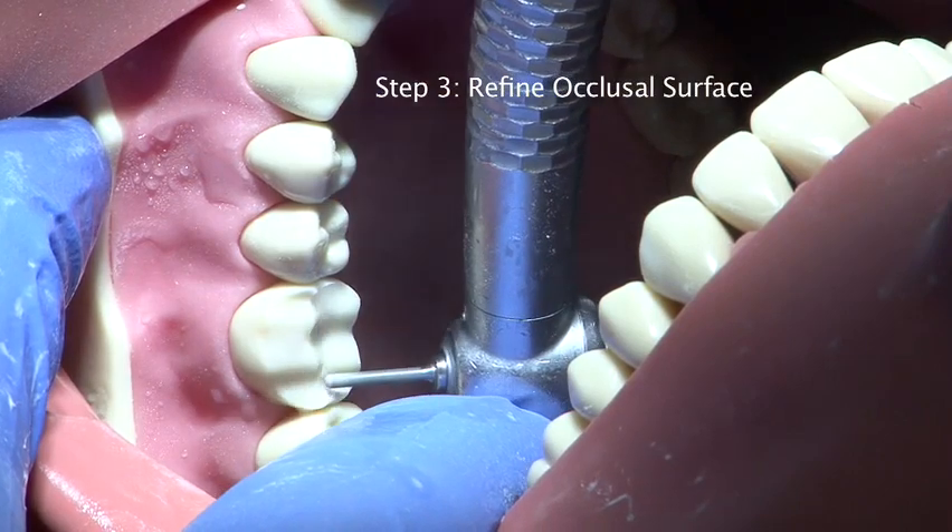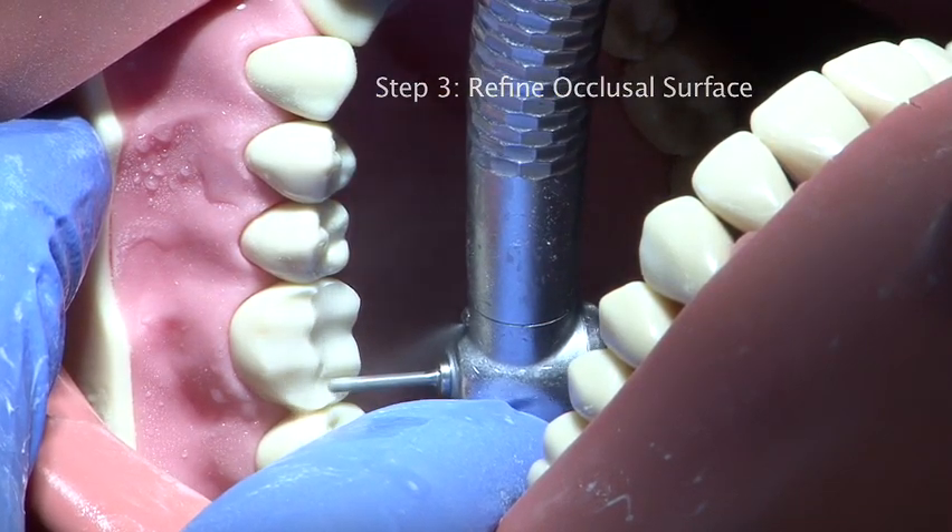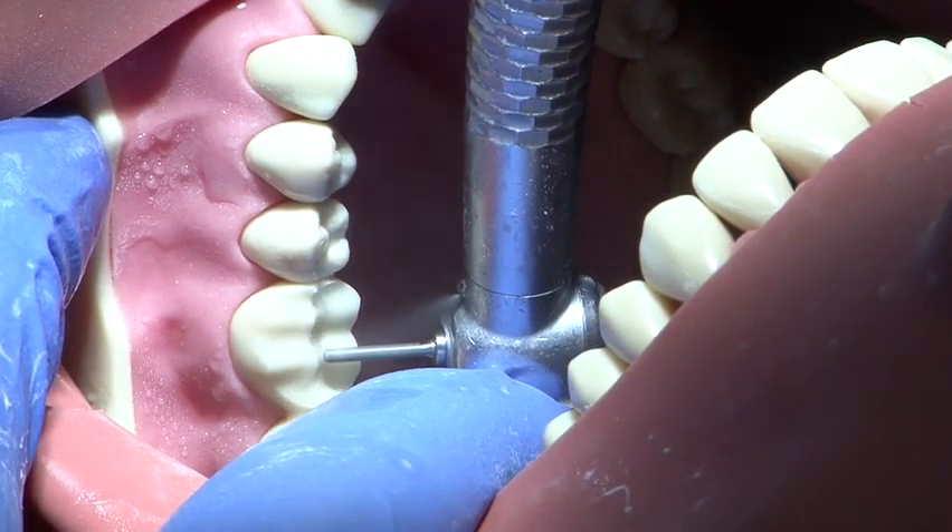Following occlusal reduction, the surface is refined using a fine grit burr.